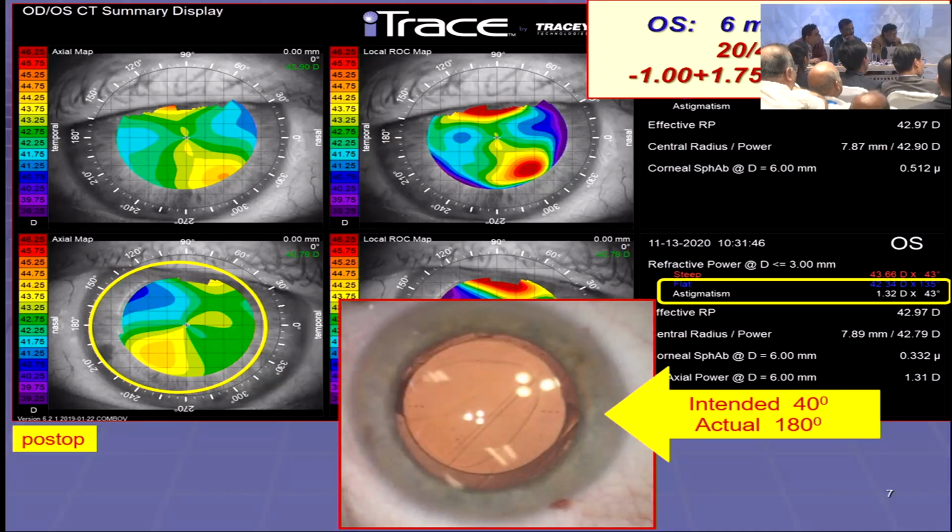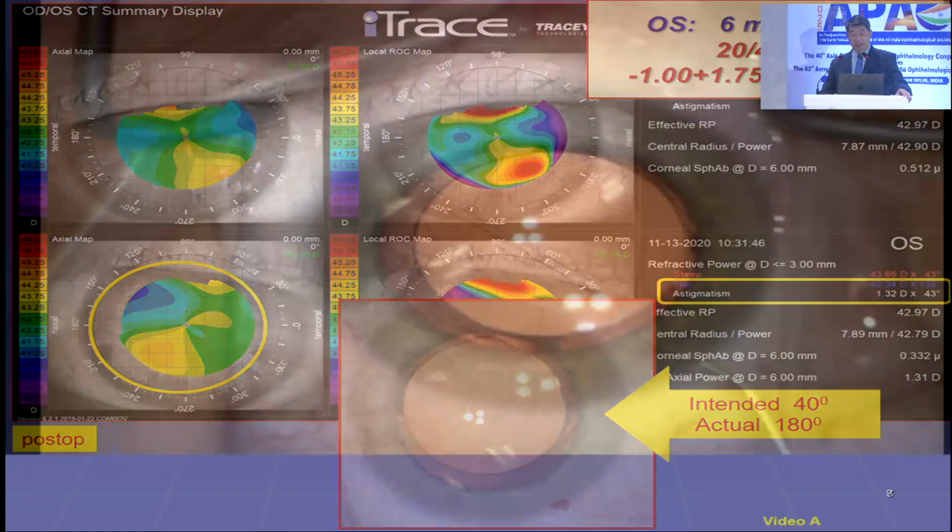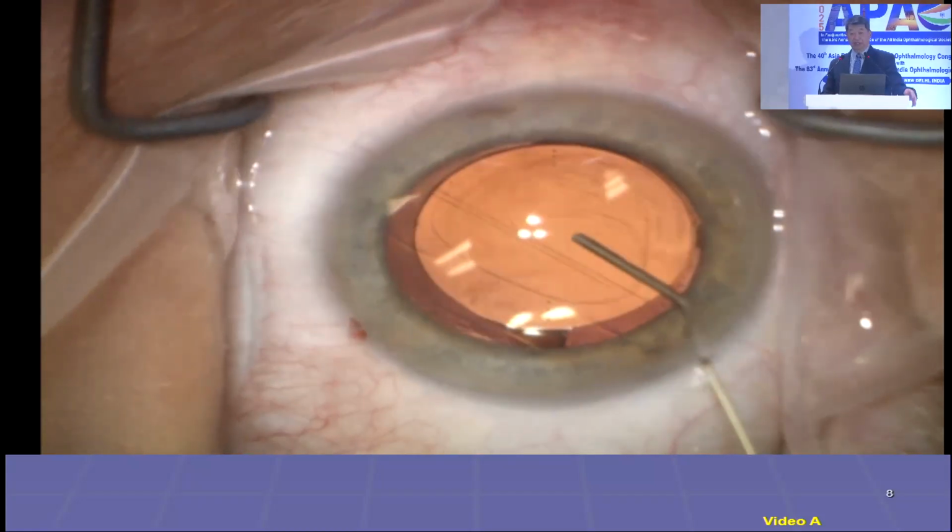I think the two things that are encouraging are that if we could get it rotated 140 degrees, she'd be plano. And the second thing is, sometimes you see a small fibrotic capsulorhexis at this point. This one isn't fibrotic. So I'm with you guys. I told her, I think if we rotated it, we could get you seeing a lot better.